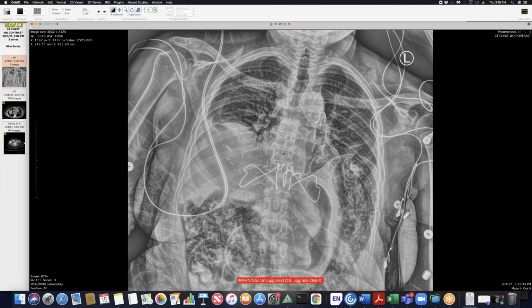Okay, those are my cases. So it's hard. Those cases can be hard, and really would like to have a non-contrast CT. Yeah. And you would like, ideally, the surgeons to actually talk to the radiologist more often. Yeah. Great cases. Thank you, Howard.